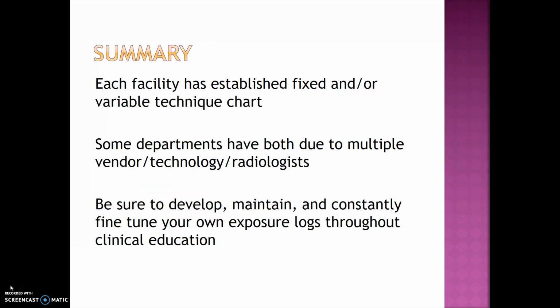In summary, each facility has an established fixed and/or variable technique chart. Some departments have both due to multiple vendor technology or radiologists. Be sure to develop, maintain, and constantly fine-tune your own exposure logs throughout your clinical education and your career.